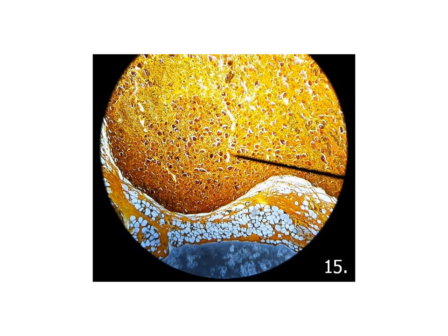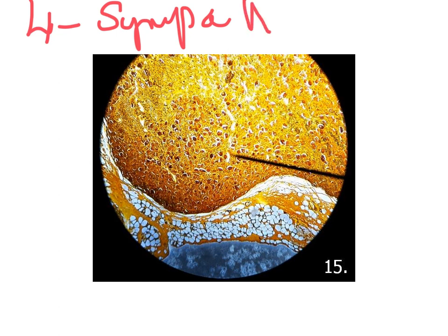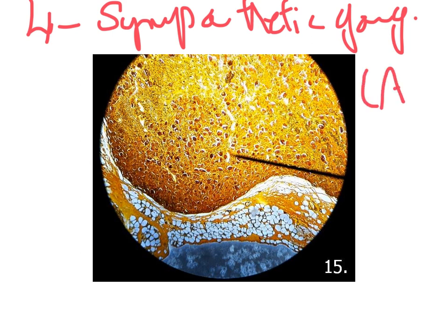So the diagnosis of this slide, which is the fourth slide in this group, is the sympathetic ganglion stained with silver.